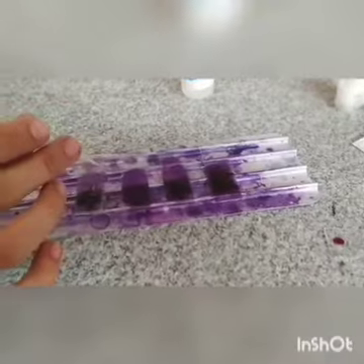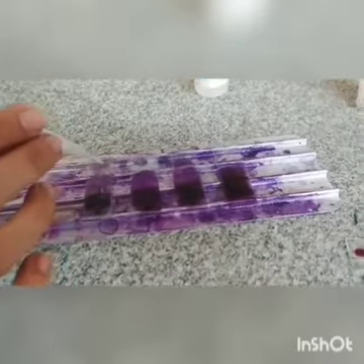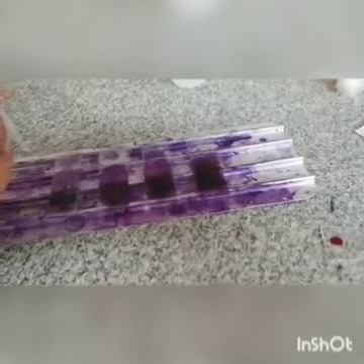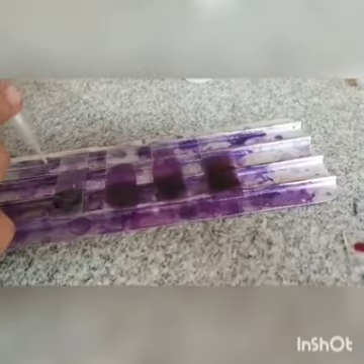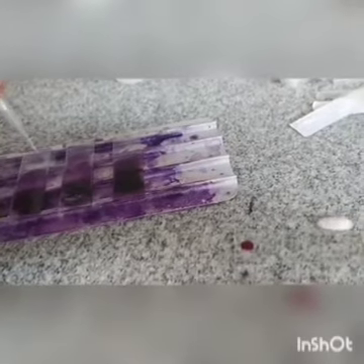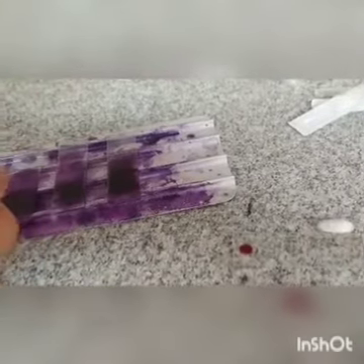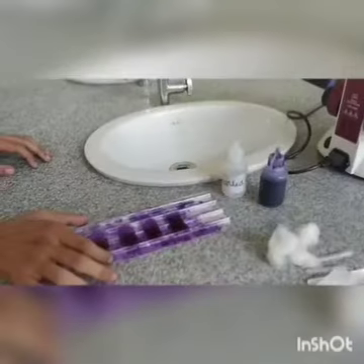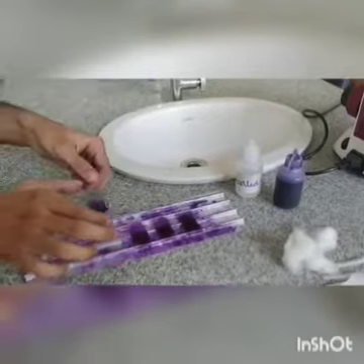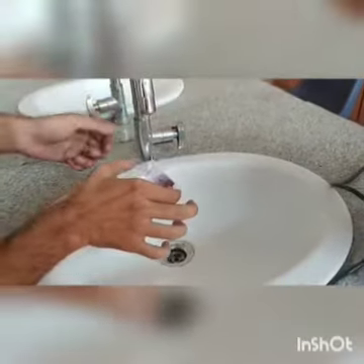With the help of a pipette open on both sides, blow on the slide to mix the stain and distilled water like this. And wait for 8 to 10 minutes. 10 minutes is completed. Then we wash the slide like this at a slanting position.